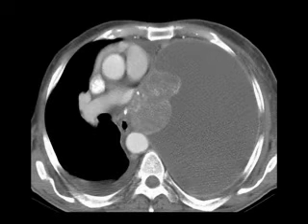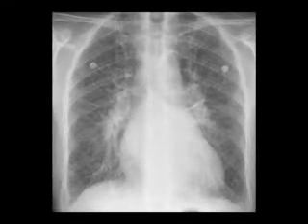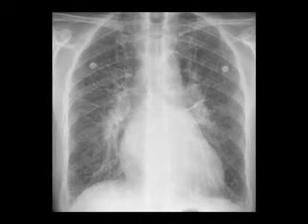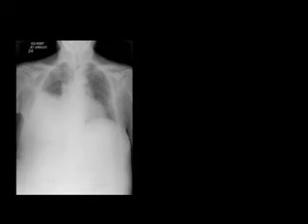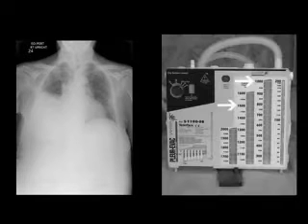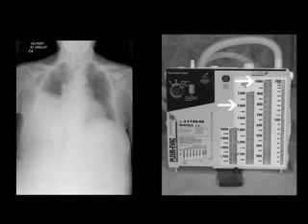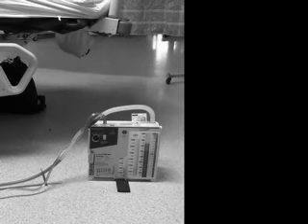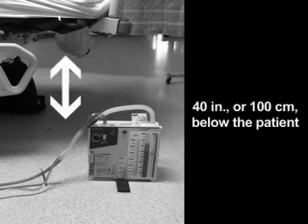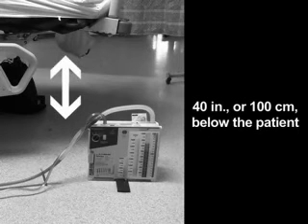When evacuating chronic large pleural effusions, the risk of re-expansion pulmonary edema has been well described. A step-wise approach to the drainage of chronic large pleural effusions is recommended, not exceeding 1 to 1.5 liters within a 30-minute period. The pleural drainage system must be kept approximately 40 inches below the patient in order to prevent retrograde flow of air or fluid back into the pleural space.